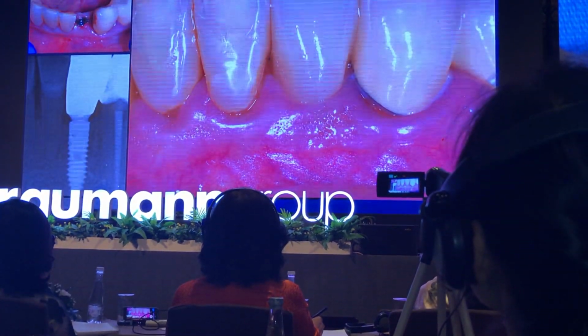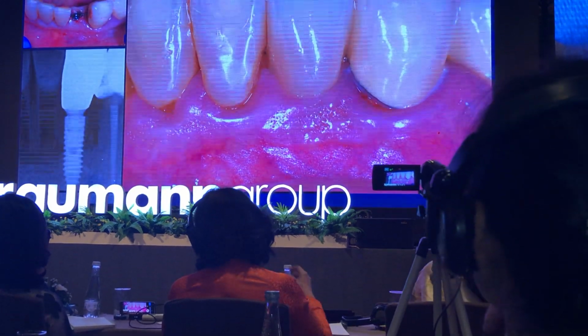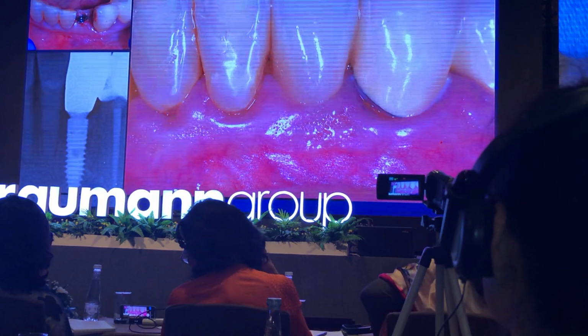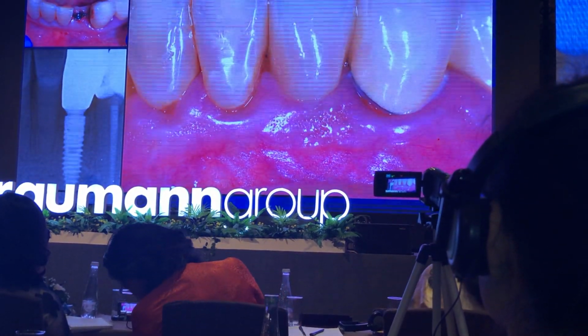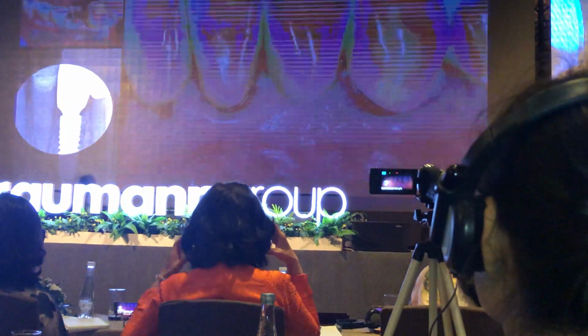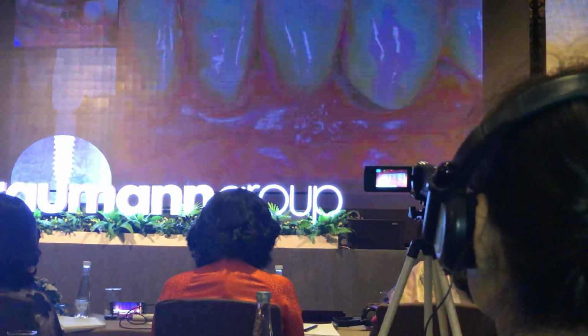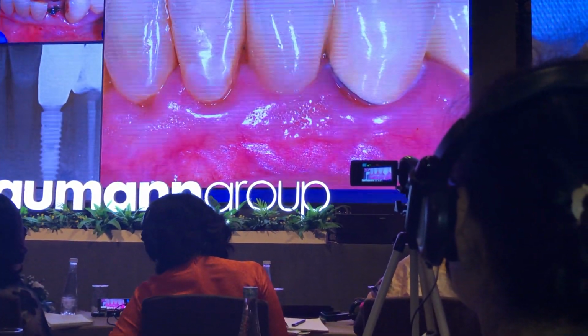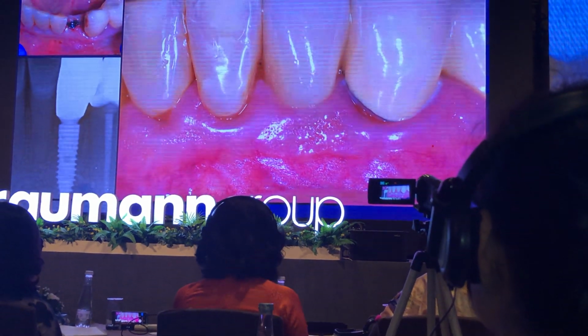Okay, and here you see now the patient at reopening at 8 weeks, and you see the patient at the 1-year follow-up. Beautiful outcome. Here you see the radiograph that looks actually pretty good. BLT 2.9. It's a very slim implant, very slim.